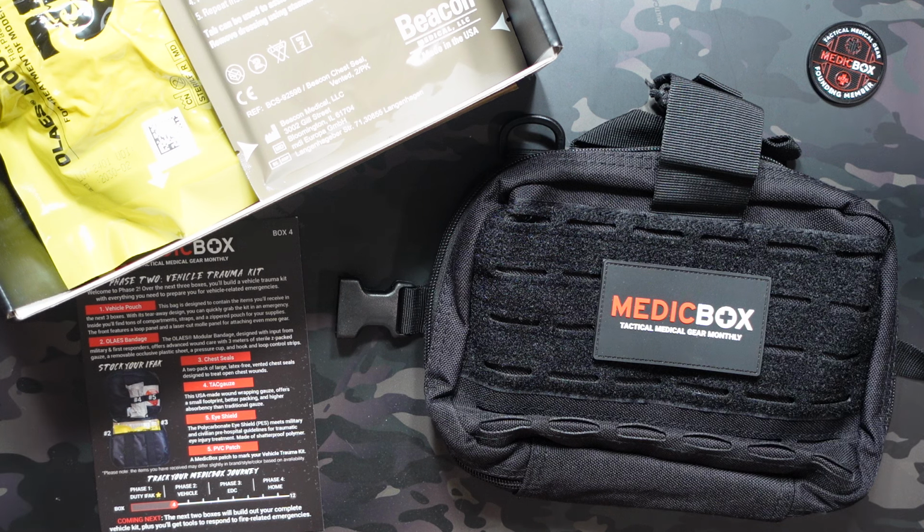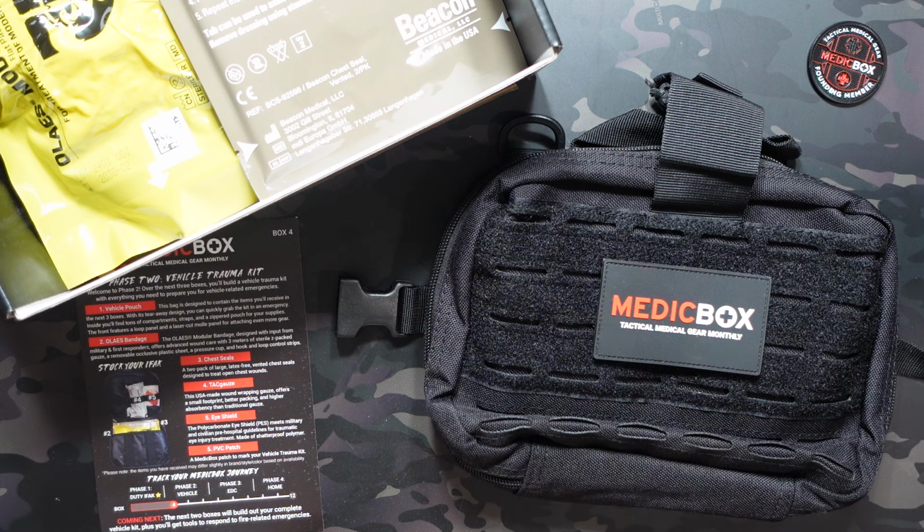One thing worth noting that we kind of learned with the duty first aid kit is although it will contain most of the items, a lot of the items are meant to be standalone items that are maybe mounted to the exterior for quicker access. And so there may be some items that don't necessarily fit in here that you're supposed to mount next to it or nearby. And so definitely something to keep in mind as well.